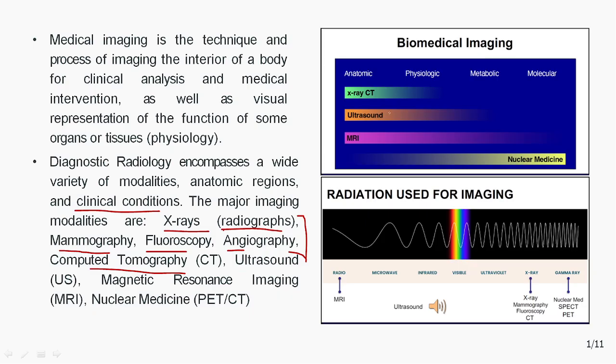Then we have other energy sources we can utilize for imaging, that is ultrasound. The next one is MRI, magnetic resonance imaging.